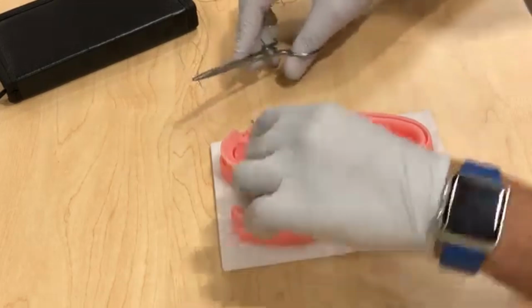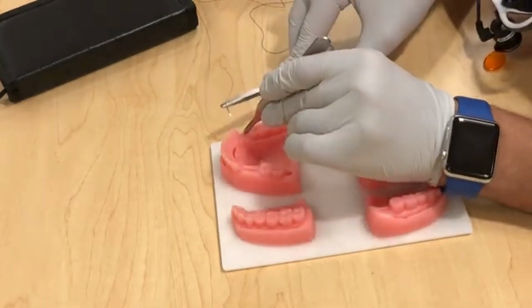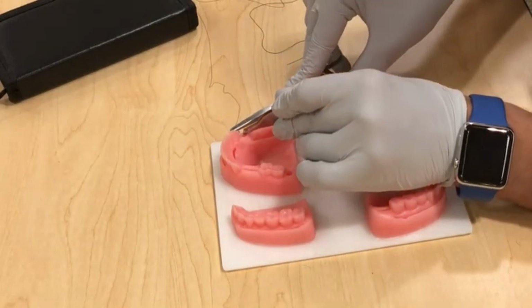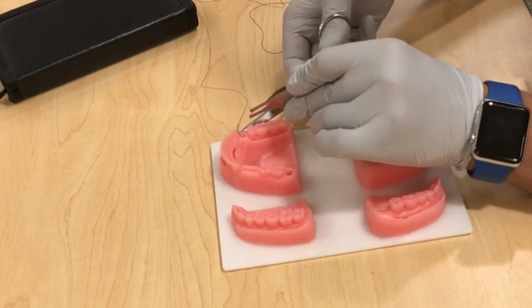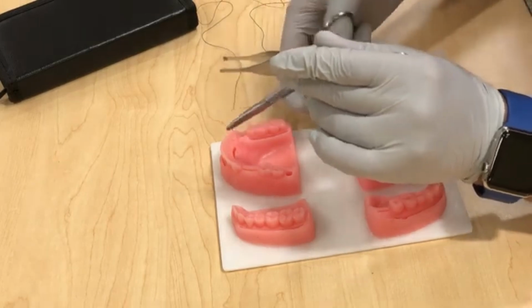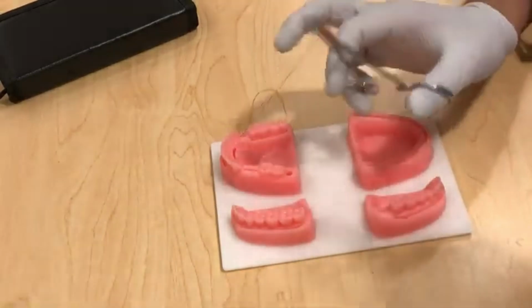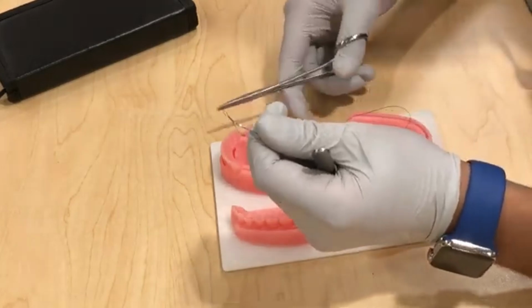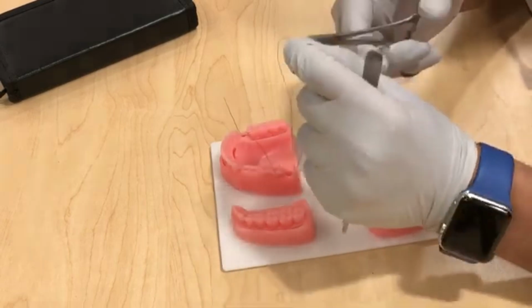Okay, so I'm gonna use my tissue holder to hold the tissue, and then you would want to enter at 90 degrees through the tissue, and then you want to assess how deep you want to go, and then you would rotate like that. You could either do one bite or you could do 2 bites at a time. I just did 1 bite right now. And then you'd want to pull all the way and have a short end, about an inch maybe.